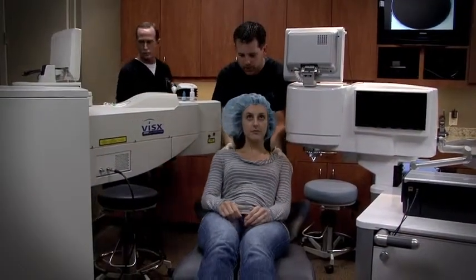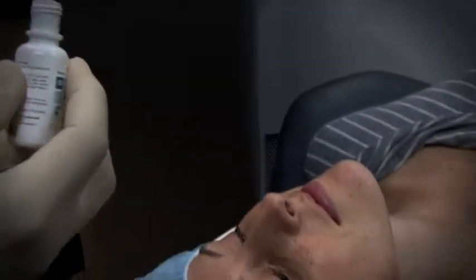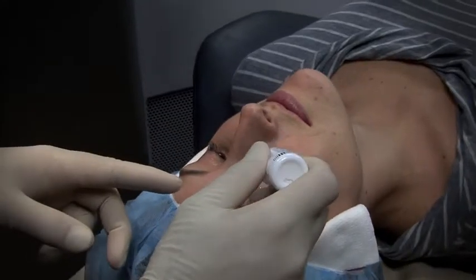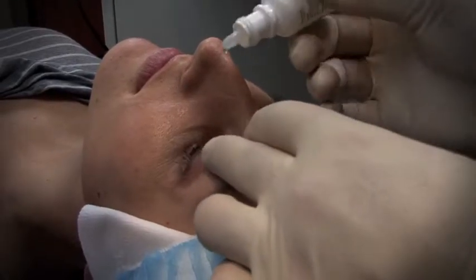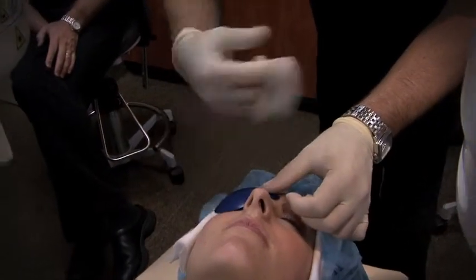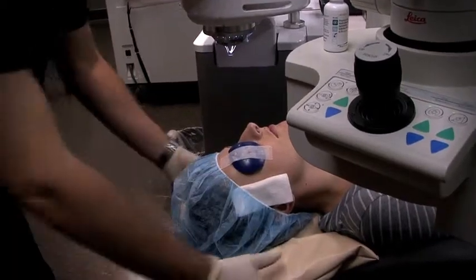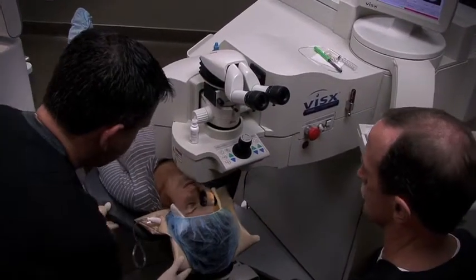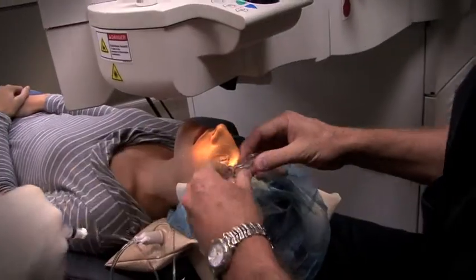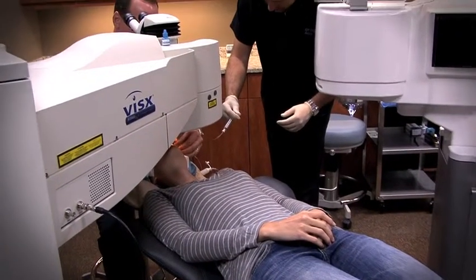Once in the surgery suite, we will lay you down on a bed and begin by numbing the eyes with some eye drops. The drops we use work on contact and will keep your eyes numb for the duration of your procedure. You'll be placed under a microscope where you will see a target light. Your instructions are to look at that target. A mark will be placed on your cornea by your surgeon, and a suction ring will be placed under your upper and lower eyelids. Your surgeon will say suction on, and I will apply suction pressure to your eye.